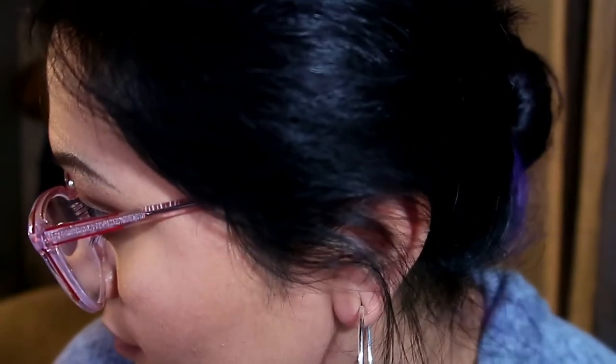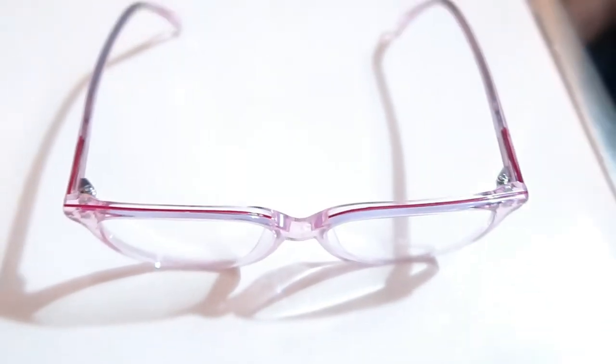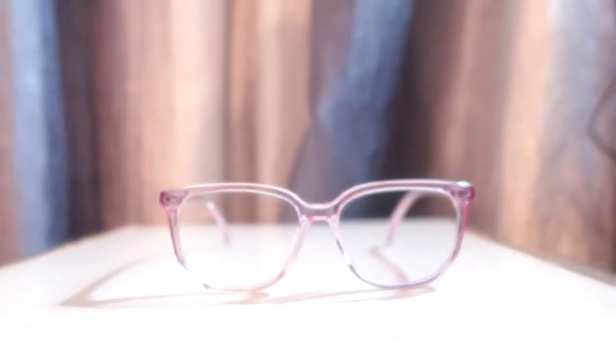Oh my God, I'm so excited. These will be my second pair of glasses. From holding them right now, they do feel very lightweight. I'll show you an up-close shot. They have red on the top — I don't know if you can see it. They are actually really cute. When you put on glasses — and I know this because I'm an unlicensed optician — you want your temples to go straight back. That usually means the glasses fit your face.